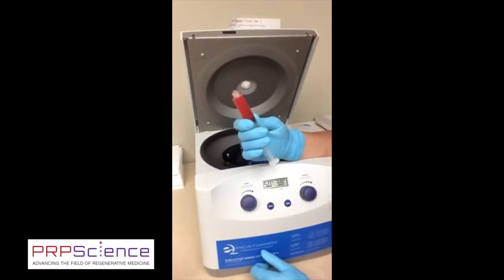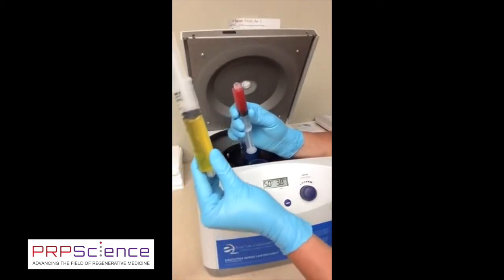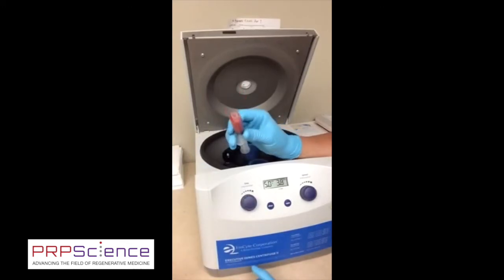And if you were to have washed the red blood cells out of the little tubing after the first spin, you would have a very yellow plasma like the platelet-poor. Okay, so either way, this is typically fine. Sometimes physicians will choose for no red blood cells, and that's one of the beautiful things about this EMCYTE system, is that you get to decide, and you have a very high yield anti-inflammatory platelet-rich plasma.